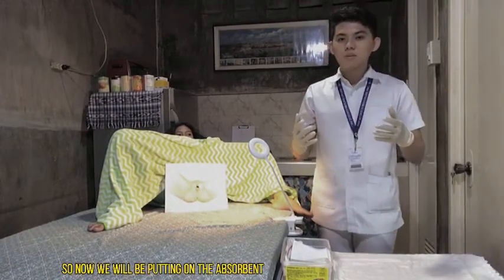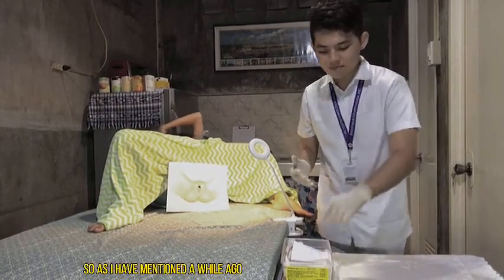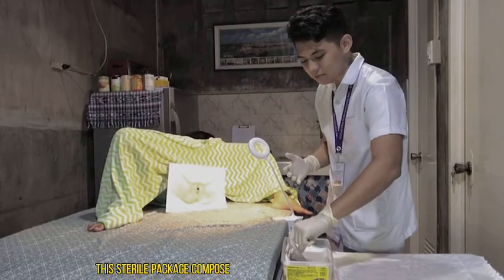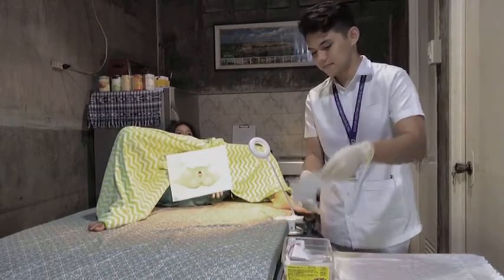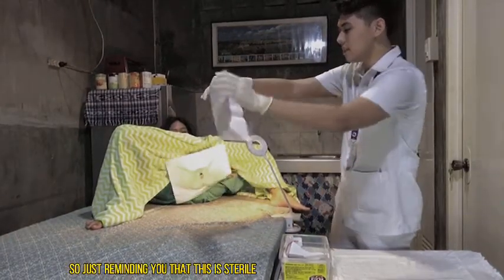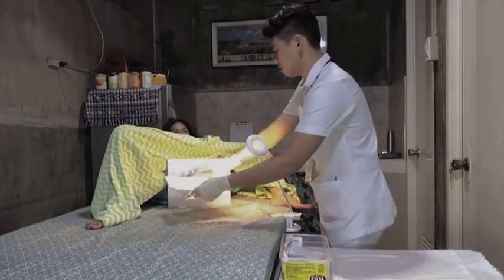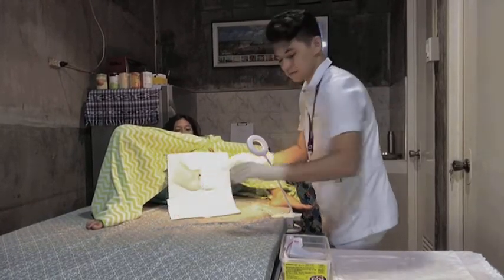So now we will be putting on the absorbent pad and the eye sheet. So as I have mentioned a while ago, this sterile package is composed of an eye sheet and a pad. So just reminding you that this is sterile. Arrange.